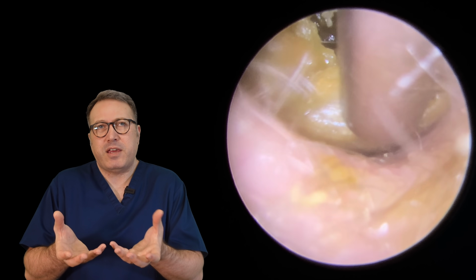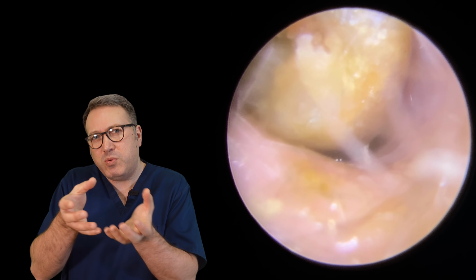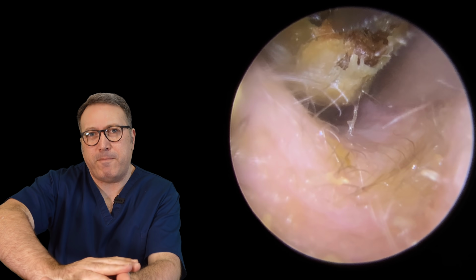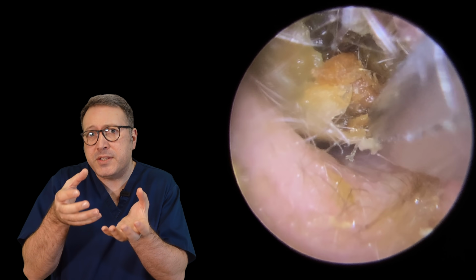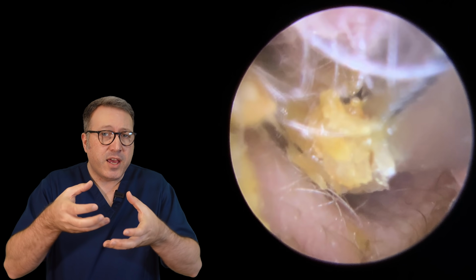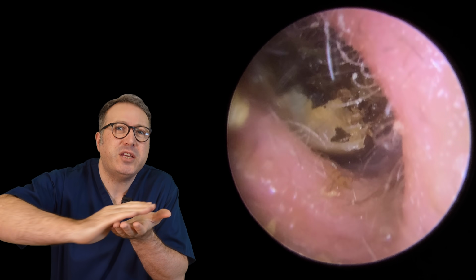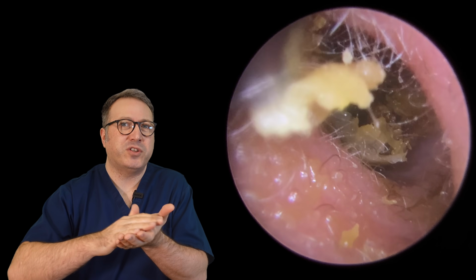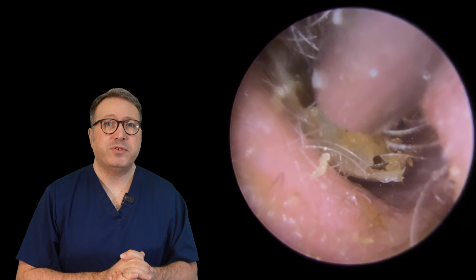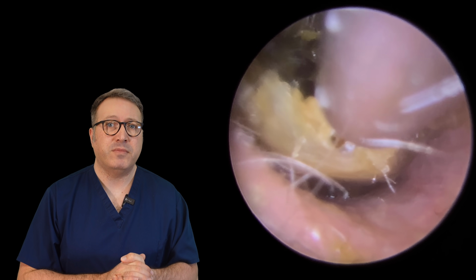Now, the difficulty here is the wax is quite dry, so it's dried around that piece of skin as well. So sometimes we can use the skin almost like a little sled and we can hold onto it and pull the wax with it. The difficulty here is the skin is still holding onto the canal walls really firmly. So as hard as I'm pulling from the front, the skin is also holding itself in at the back, which means that the crocodile forceps effectively shears that dry skin rather than draws it out as it did with the piece you saw that came off the top earlier. So we're just working our way around the outside edge here, lifting from the bottom there.